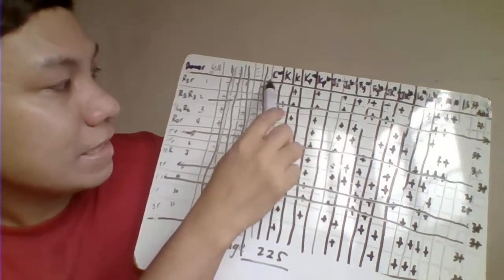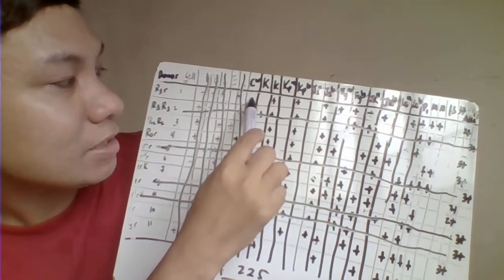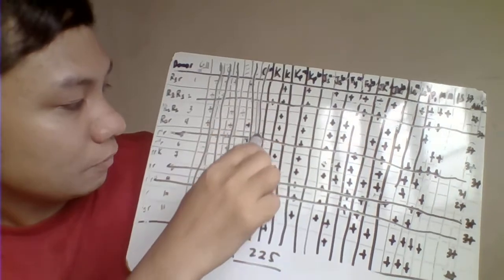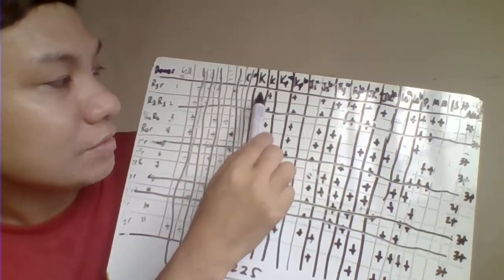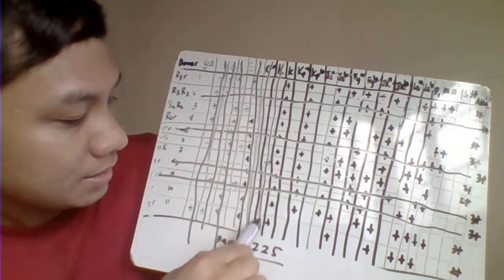Okay, then we have your CW, negative na. Dapat positive dito. Negative siya dito pa lang sa number 1 natin. We're supposed to be positive. So, hindi din ito. Okay, your Kel here. Dapat positive dito since negative ang result niya. Okay, so hindi din ito hinahanap natin.